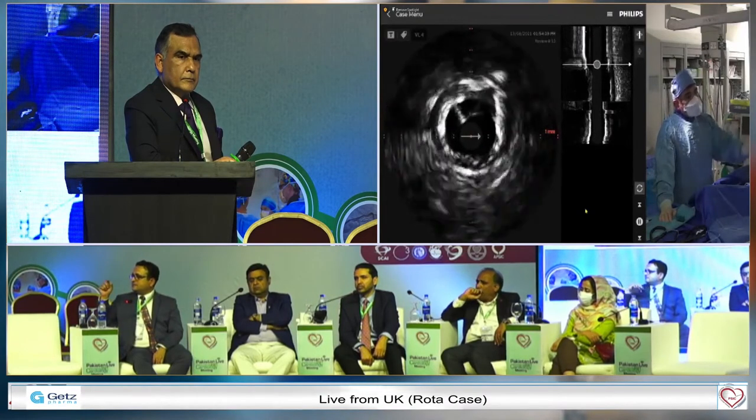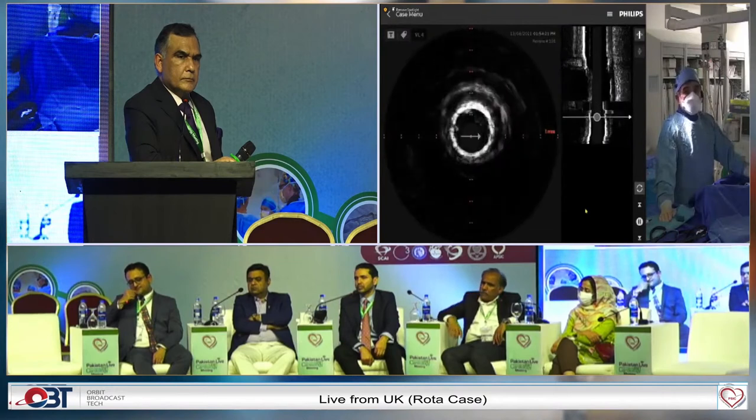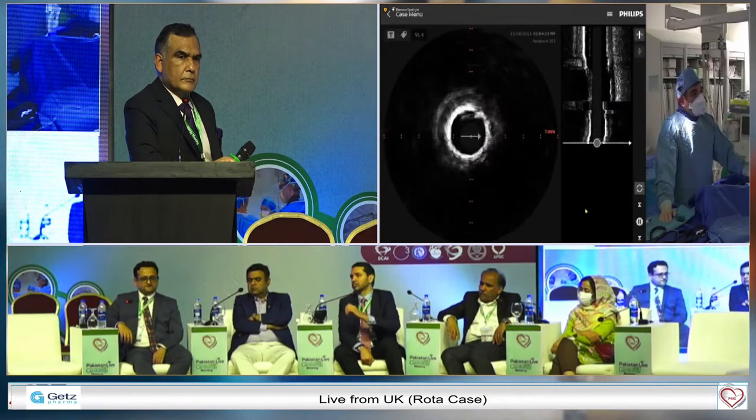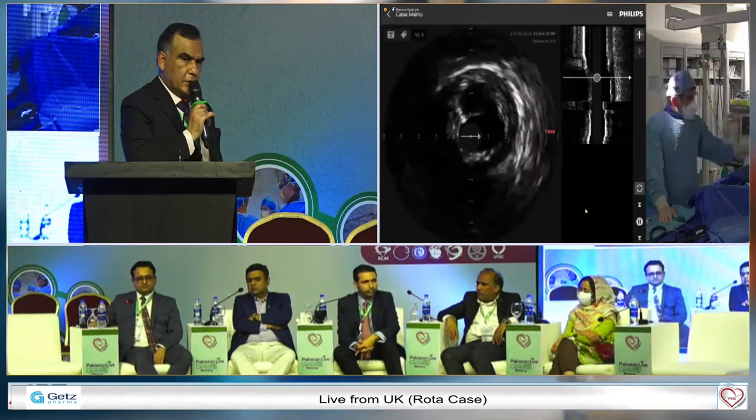And as we mentioned, the IVUS thing used to be called the Washington test. If the IVUS doesn't go down, then you need to do some debulking. Can we see the IVUS? Can you see the IVUS on the screen? Yes, please. Can you comment on this?